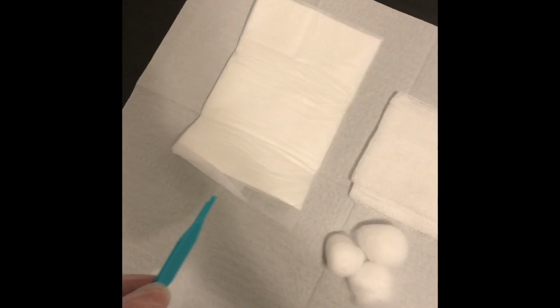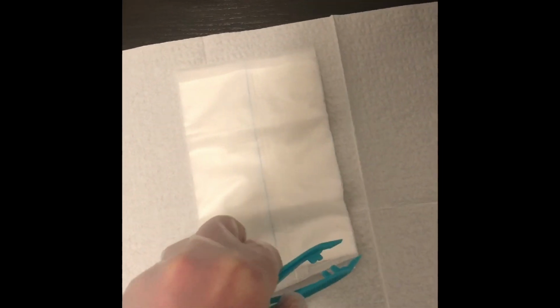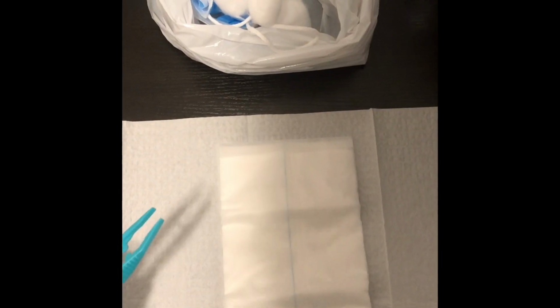After this step, the student will be required to measure the length and width of the wound. After properly cleansing the wound, we will now be applying the new dressing. After applying the new dressing, we will now secure it tightly with tape. After properly securing the new dressing, the student is responsible for labeling the dressing with the time, initials, and date on the tape.